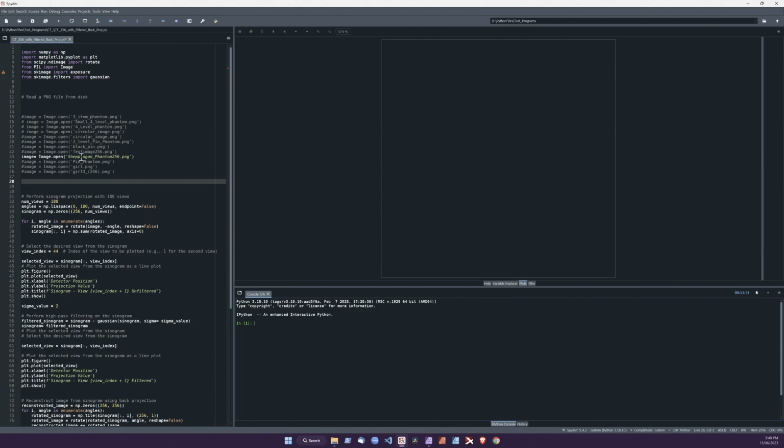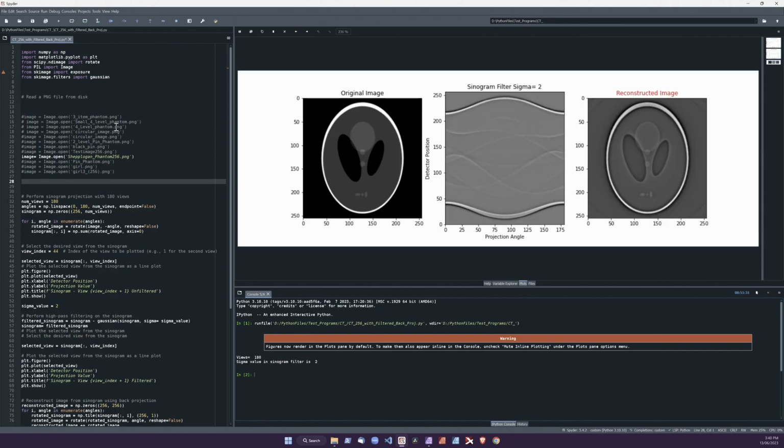The first one is this Shepp-Logan here, which is an official CT test phantom. So we'll just run the program on that. And there we see the original image, which is the one I obtained, the sinogram of that image, and then the reconstructed image. Now the reconstructed image is of much less contrast than the original, but that is purely due to lack of development of the program. The thing has reconstructed properly. As you can see, all the bits and pieces in the phantom are showing up properly in the reconstructed image. The sinogram is being sharpened. The sharpening figure here is given as 2.